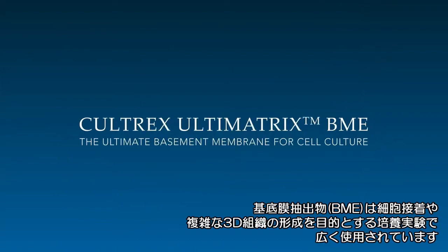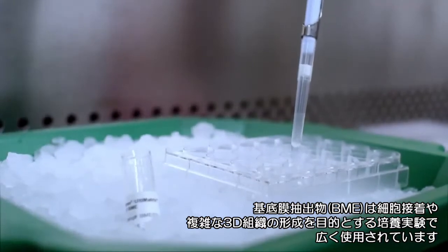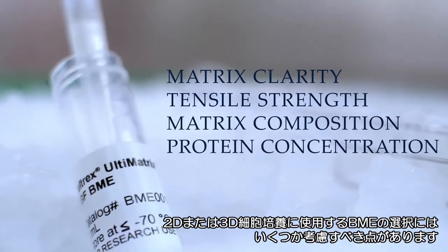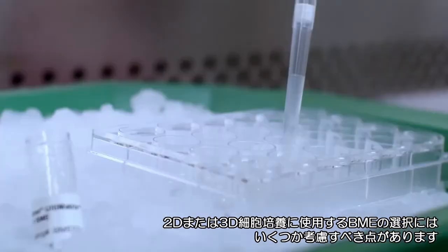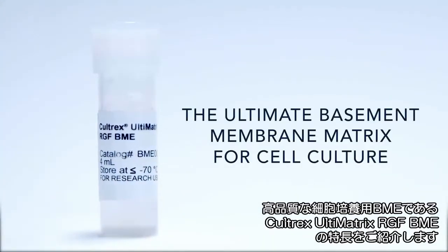Basement Membrane Extract, or BME, is used globally for culture applications requiring cell attachment or complex three-dimensional tissue development. When choosing a basement membrane for 2D or 3D cell culture, specific criteria should be considered. In this video, we describe the importance of these criteria and introduce R&D Systems' Cultrex Ultimatrix BME, our ultimate basement membrane matrix for cell culture.